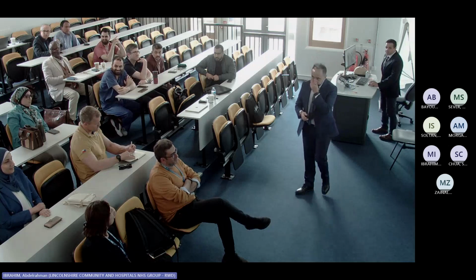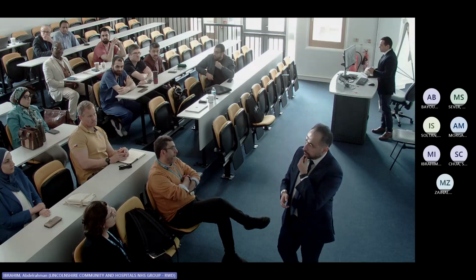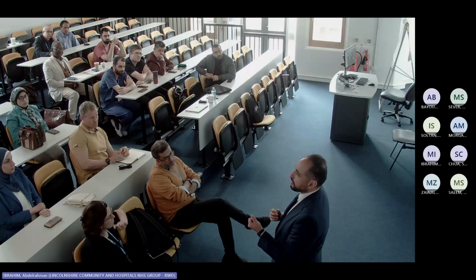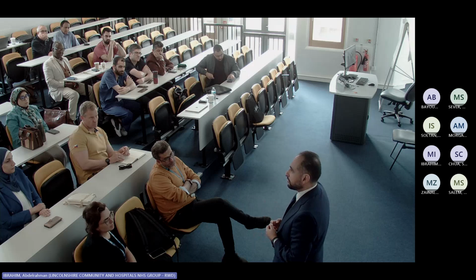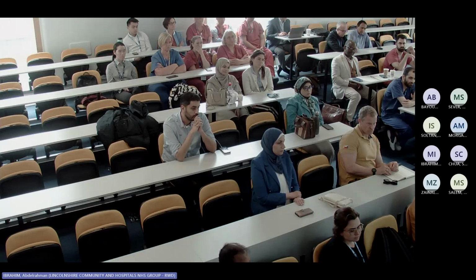The 2 minutes that you dilate, is there any role for increasing or decreasing depending on the ETD questionnaire score? Has anyone looked into this? You mean how much pressure you need, according to the score? Well, that's the thing. The score is a very subjective thing, okay? And it's not very solid. That's the problem with the score, the ETDQ-7 questionnaire. If you sit with a patient in the clinic and ask them how they feel the pressure, 5, 6, 7, make it 7. It's very subjective. So you can't make a subjective thing into a physical objective thing. It's really difficult. So I know what you mean.